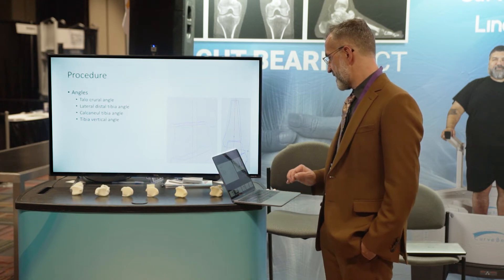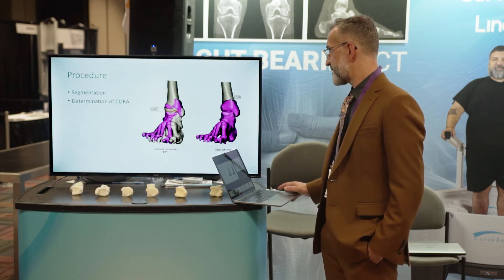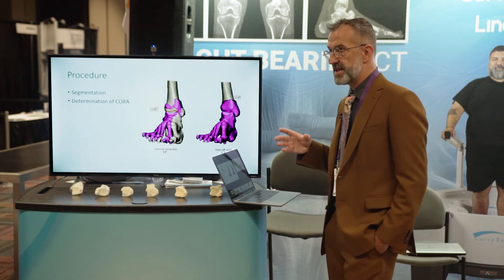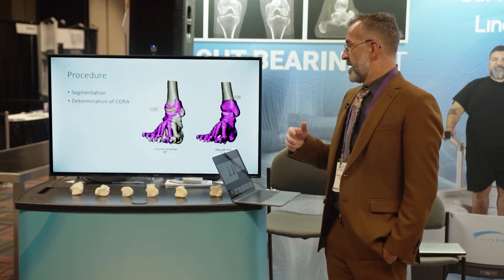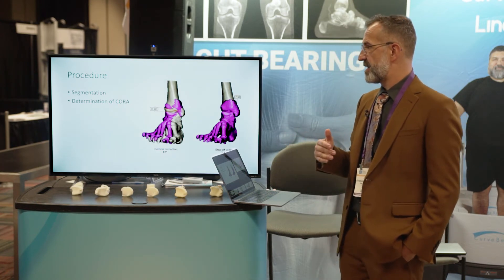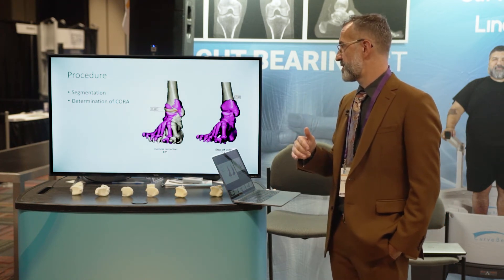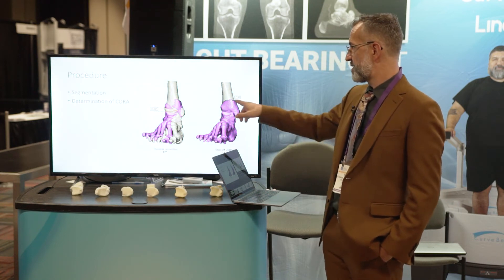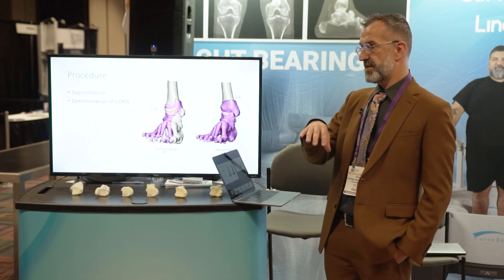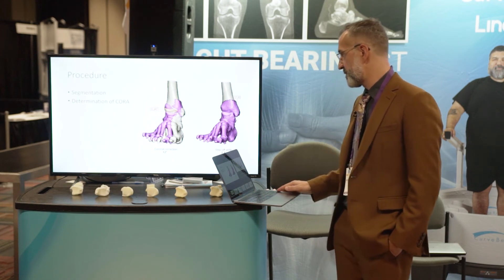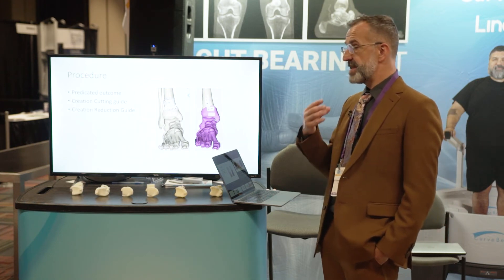The tibial vertical ankle angle is defined in the coronal plane between the tibio-talar joint line and a vertical medial line. We then perform full segmentation of the tibia and foot, determine the center of rotation near the joint, and ensure the osteotomy is in metaphyseal bone for good healing. On the medial side, there is always a step-off; if it's too large, you adjust the curve size to control the step-off.